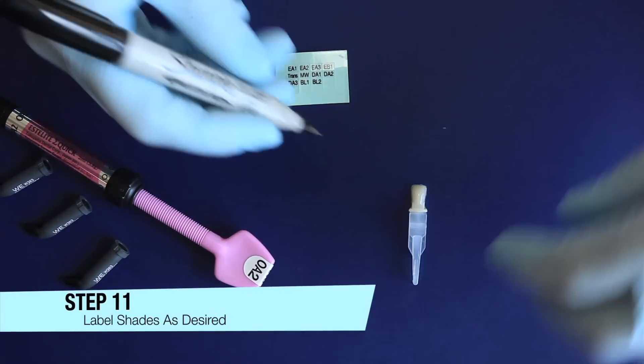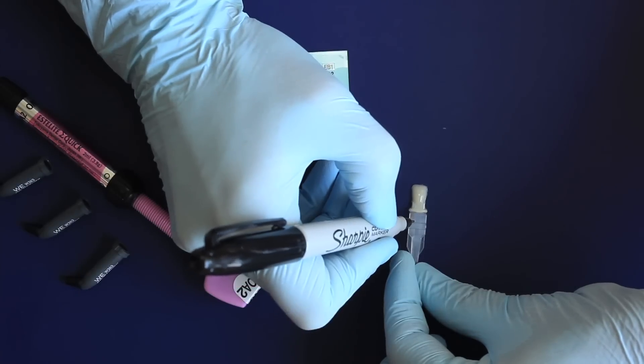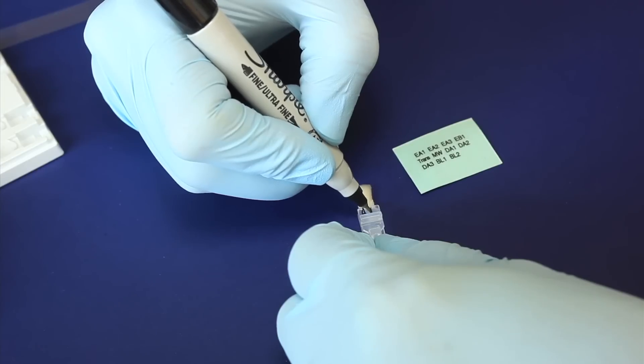Step 11: Label shades as desired using a fine tip permanent marker to write shade names on the handle. If using Estelite Omega from Tokuyama, you may use the provided shade stickers.